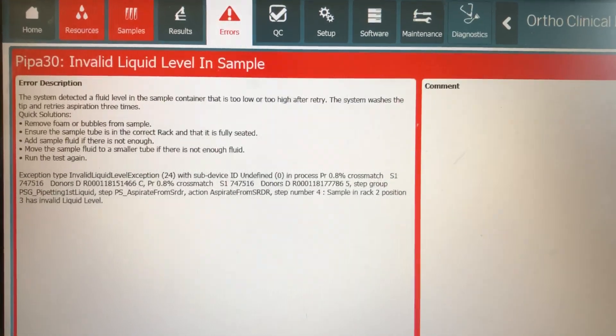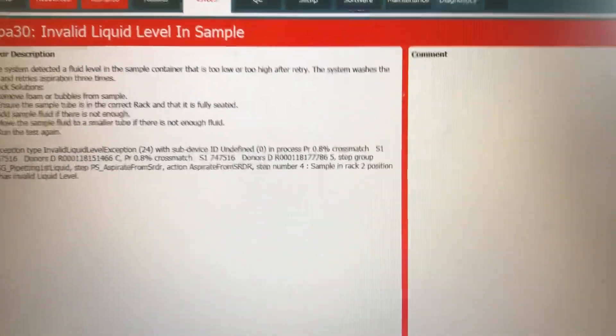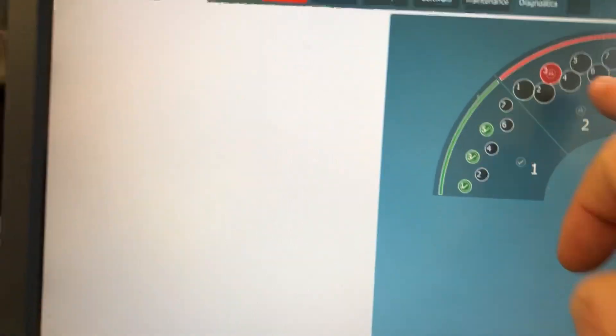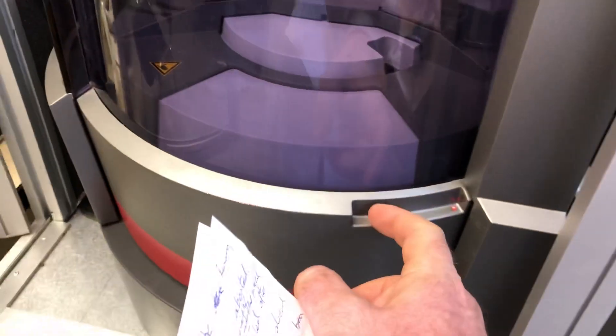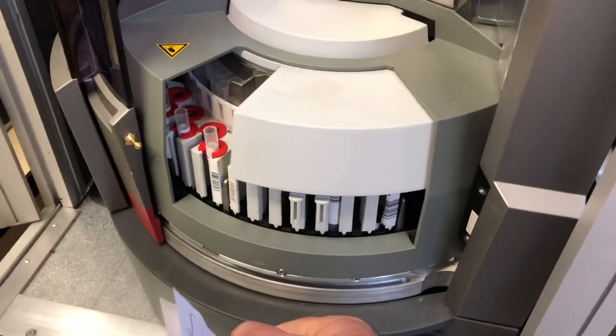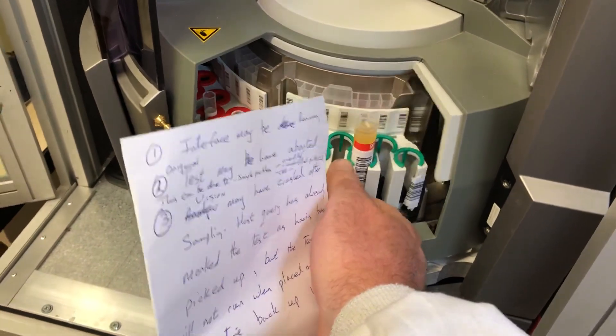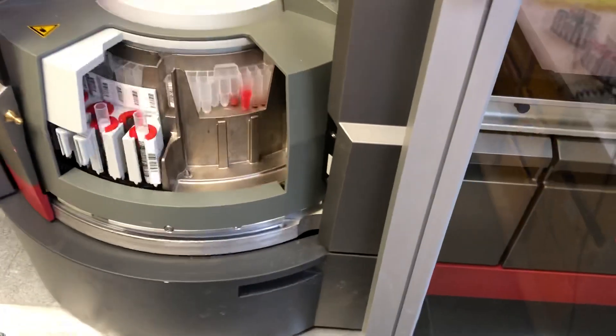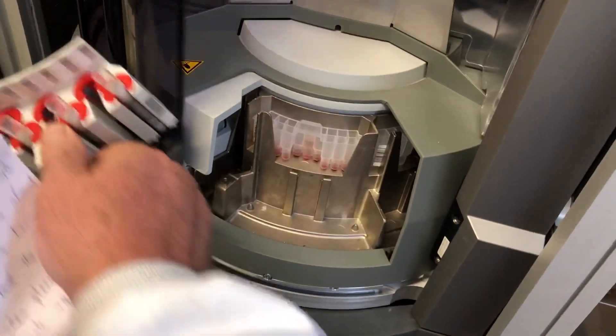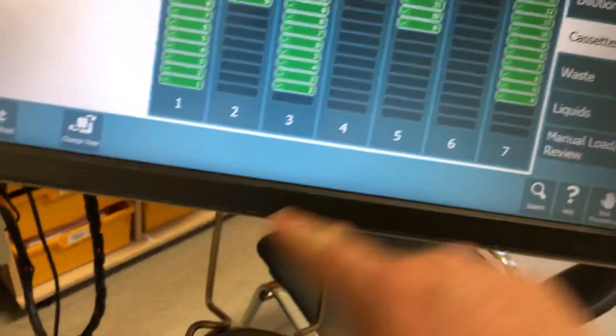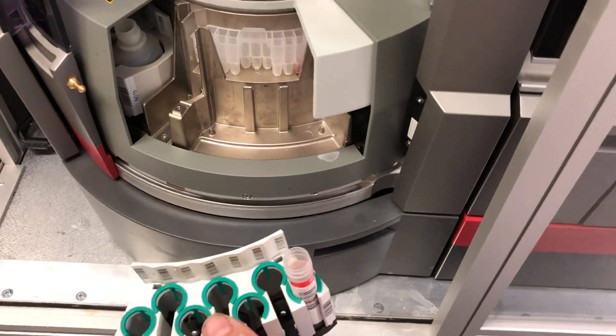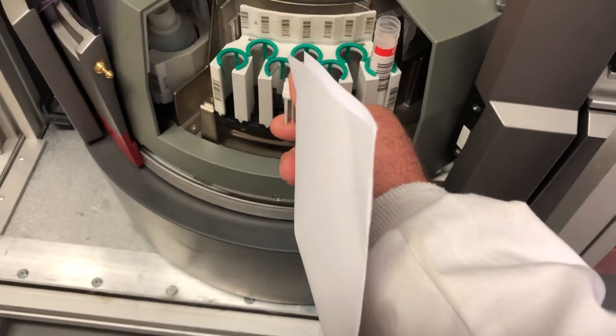Okay, but our issue is we cannot rerun the test via the interface so we're going to have to manually request the cross-match. Okay, so I'm just going to take these samples off and I'm going to manually request the tests on my backup vision. Okay, so I'm just going to log on here and I'm going to place my samples on board. You have to make sure that my samples are put in correctly and my pack cells from my donor segments.